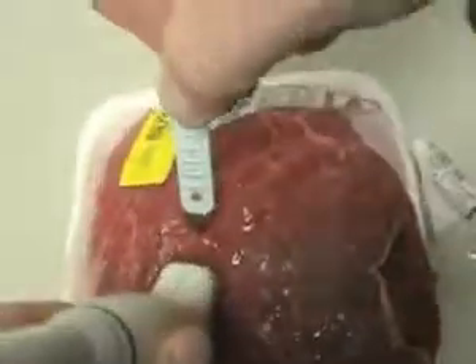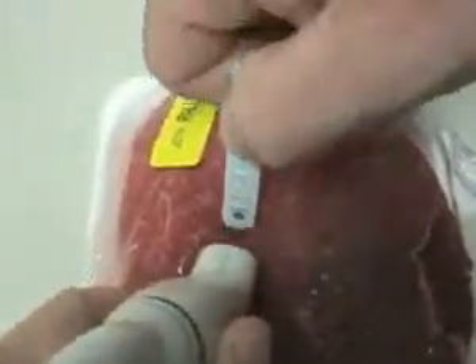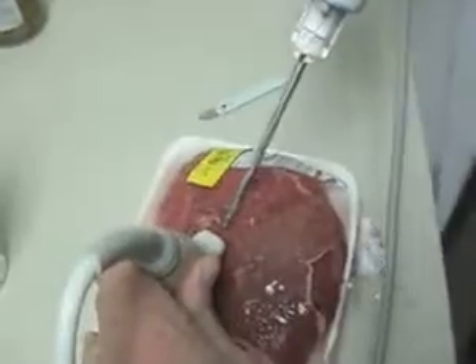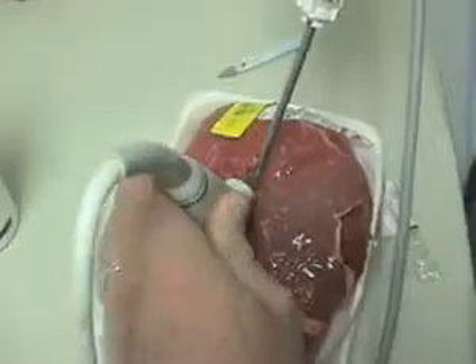I'm going to make a skin incision here. Encore is our flagship product, which is used to remove tissue from the breast for a diagnosis — to find out whether or not the tissue is cancerous. The device is image-guided by ultrasound, stereotactic x-ray, or MRI.